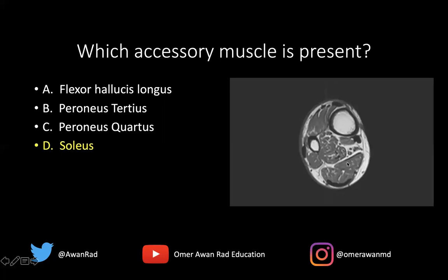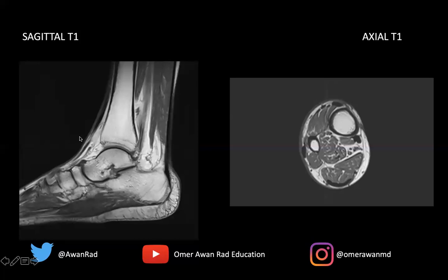We can see here that there are two structures. This is the Achilles tendon right here on the axial image. At this level — at the tibiofibular syndesmosis and below it — the soleus muscle should have already inserted onto the Achilles tendon. Coming back to this first image, there's too much soleus muscle going too far inferiorly. This fatty area here is known as Kager's fat pad, and at about this level there really should be no more muscle protruding down.